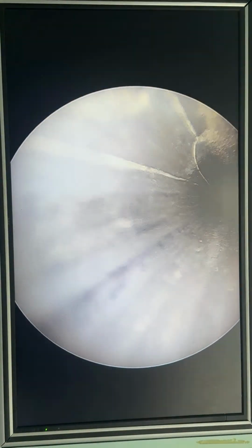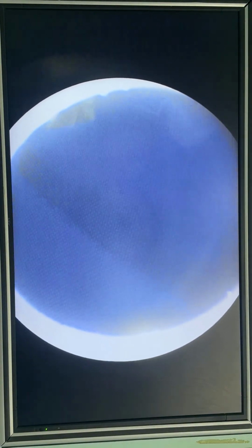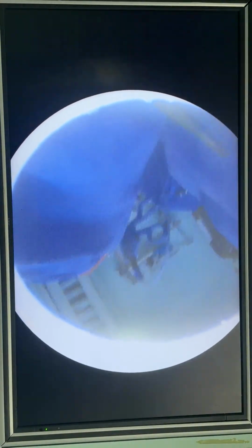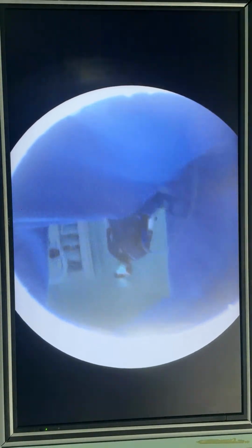Are we showing this end? Acha, are we showing the vaginal end picture? Vaginal end picture दिखा रहे हो?